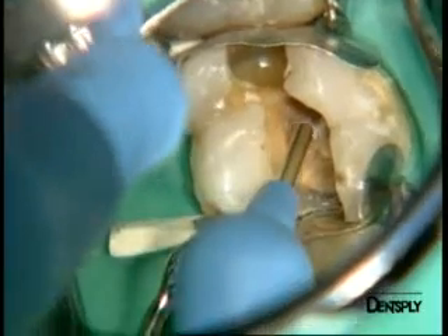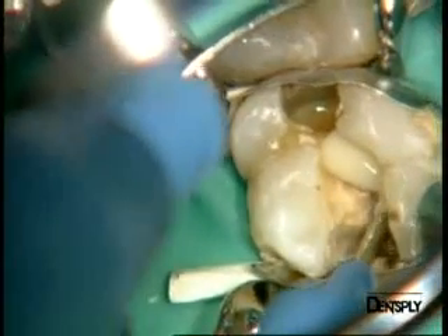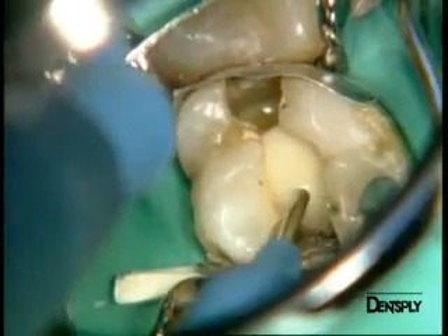X-Flow is now applied into the bottom of the cavity as a liner in a continuous procedure to avoid any inclusion of air. You can see that the product's consistency makes it very easy to place. We are still within the practitioner's control.